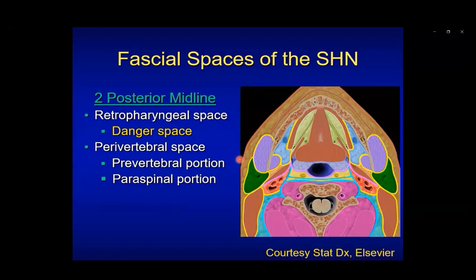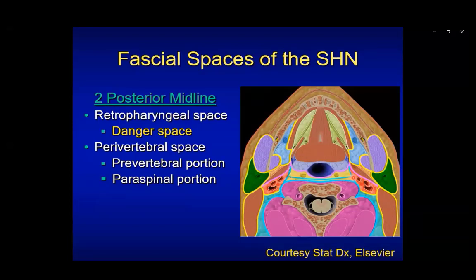There are two important posterior midline structures: the retropharyngeal and danger spaces. The retropharyngeal space is outlined by the deep layer of deep cervical fascia, with the danger space more posteriorly. It's important to remember that you can't actually differentiate these spaces on imaging. However, the danger space is a conduit for retropharyngeal space disease to extend into the mediastinum. The alar fascia provides the lateral margin of the retropharyngeal space, as well as the slip of tissue that separates the retropharyngeal from the danger space.